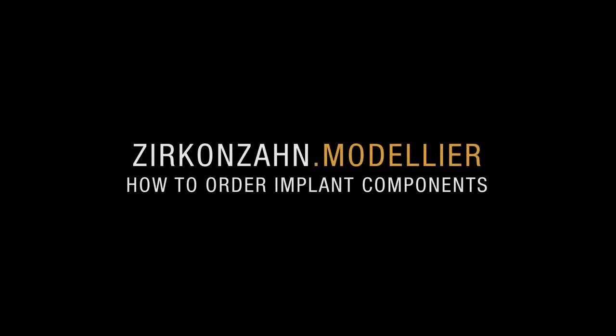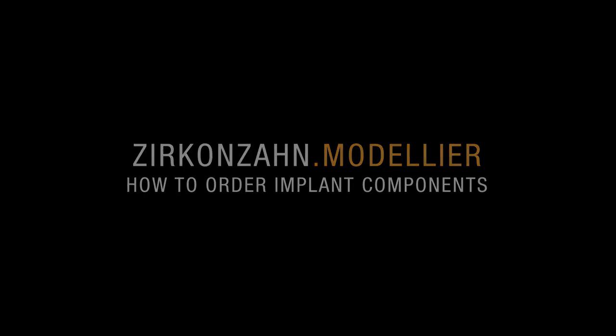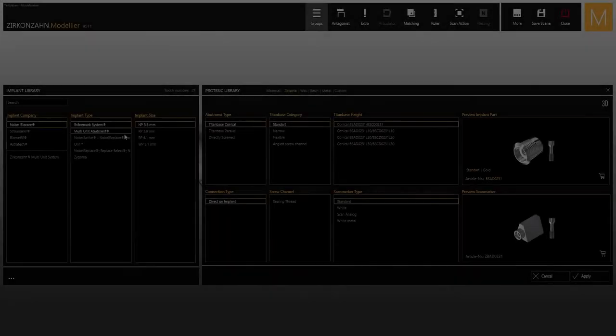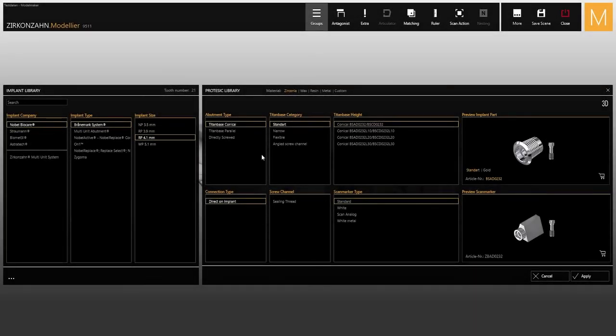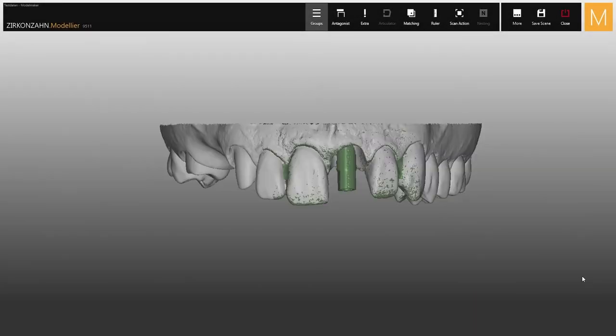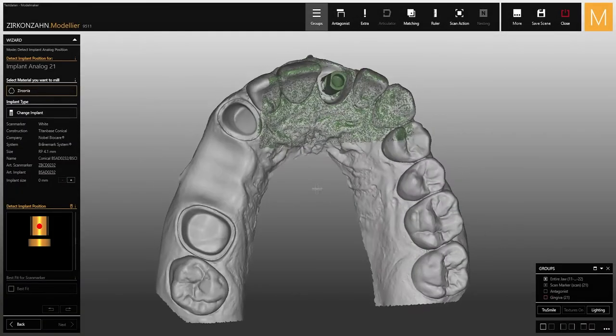With Zirkonzahn.Modellier it is now possible to order implant components directly via software in the Zirkonzahn webshop. Based on the available patient data, you can select the implant components needed.